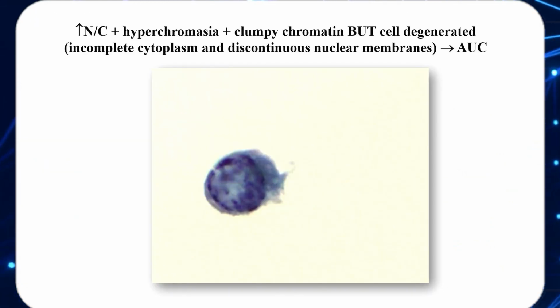This is a little different, certainly looks ominous, but look at the cytoplasm, it's already disrupted. So because of that, this is degeneration. You can certainly think of malignancy, but do not call this a suspicious call. I would actually probably place it as a negative case here based on the degeneration, but if you are so inclined, it's certainly allowable to call it atypical.